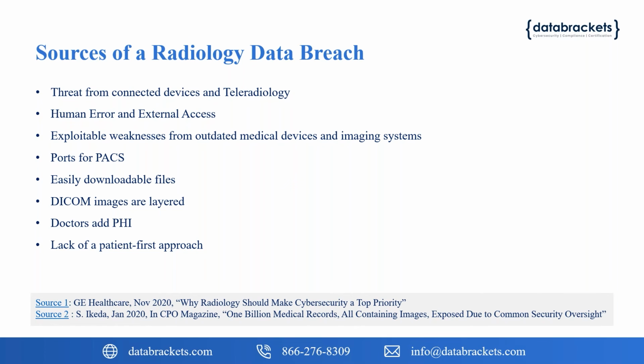So you do have a provision to capture that information as part of the file itself. Essentially you have patient-specific information plus the pixel images, and that pretty much constitutes the DICOM file. Since it's easily viewable, you run into, again, an issue of data breach.